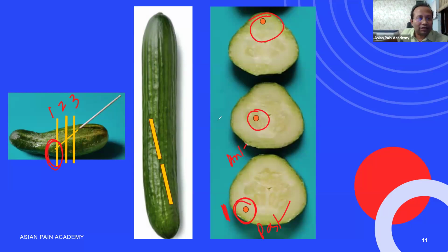So this is what I am talking about. If you see the cross section, say you think that inside the body this is an artery. So you know that this artery flows in the place of the stick. By seeing this artery you can know that the artery is flowing from anterior to posterior, and in the axial section you will see it like this.